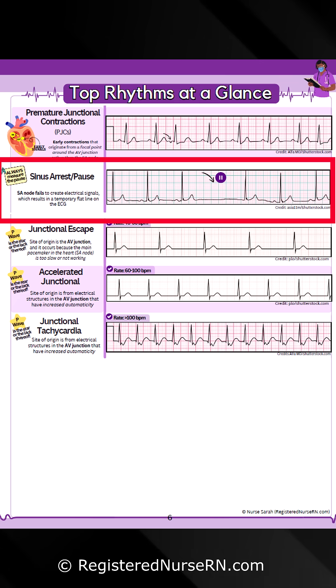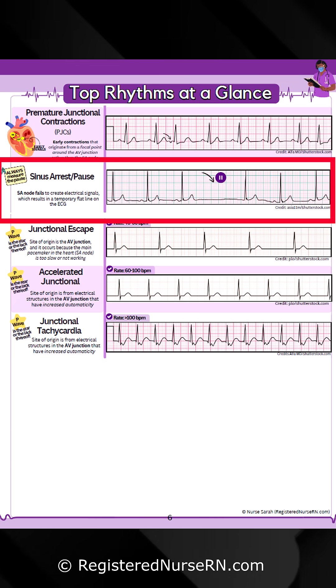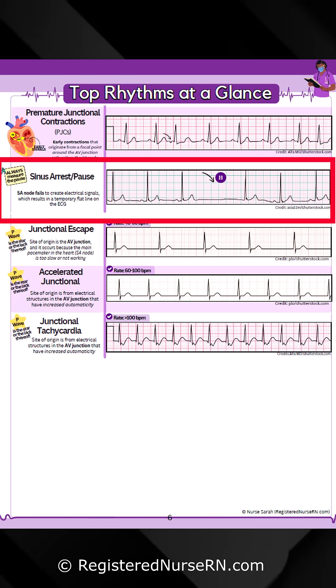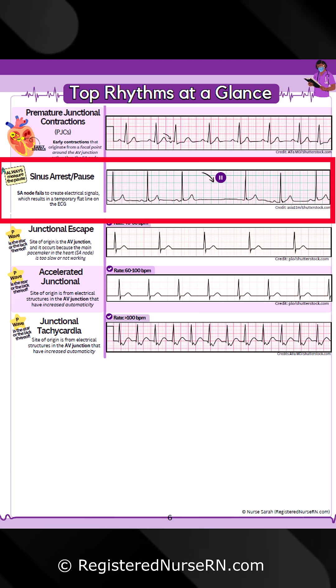Sinus arrest, or sinus pause, is where the SA node fails to create electrical signals, which results in a temporary flat line on the ECG. Always remember to measure the pause.